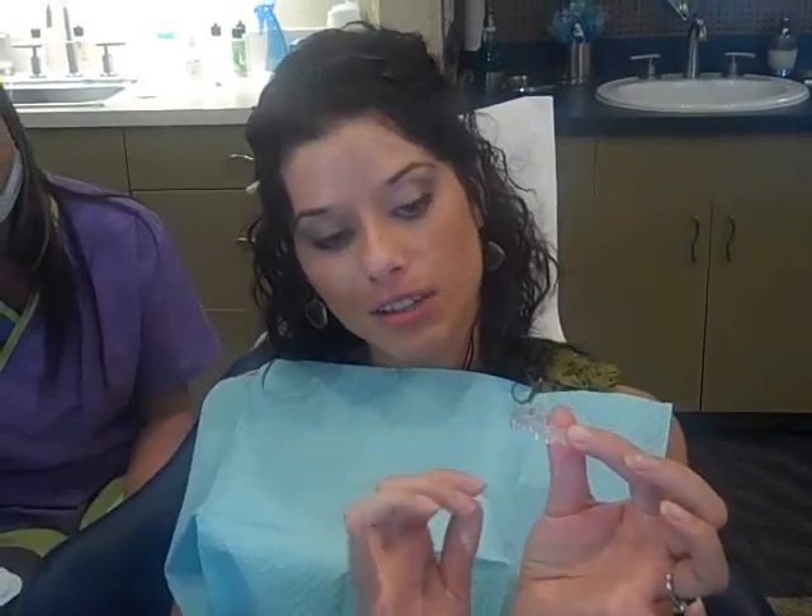They're different than like my retainers, for example. These have the actual grooves at the bottom, whereas my retainers — after I had gotten my braces off, let's just say a few years ago — they were completely solid all the way around, so they would be a little troublesome. They'd sort of irritate the gum line. This doesn't look as if it's going to do that, which is kind of exciting.